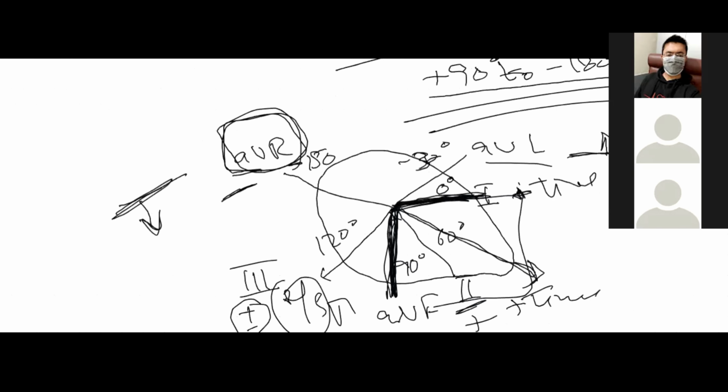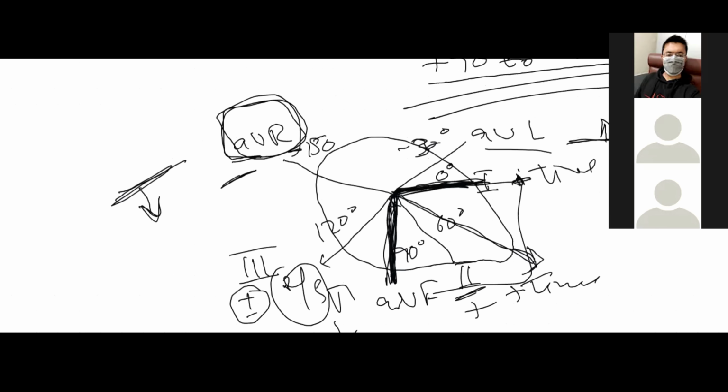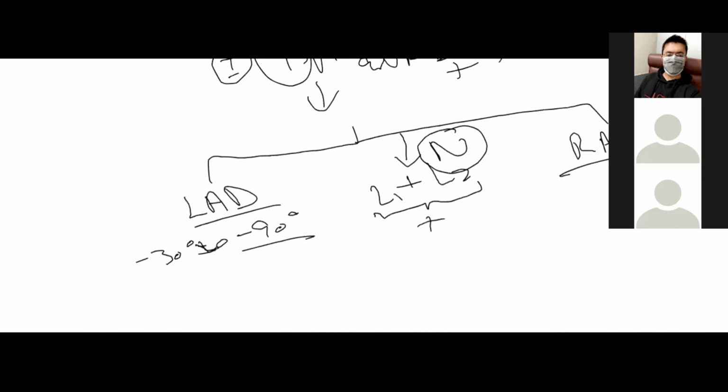So if we see this graphical representation, let me make it again. I'm so sorry. This was AVR, AVL, AVF.